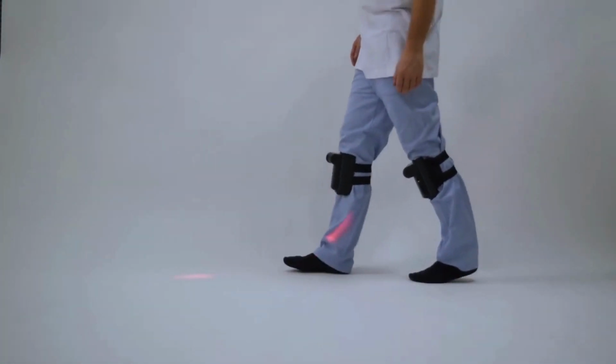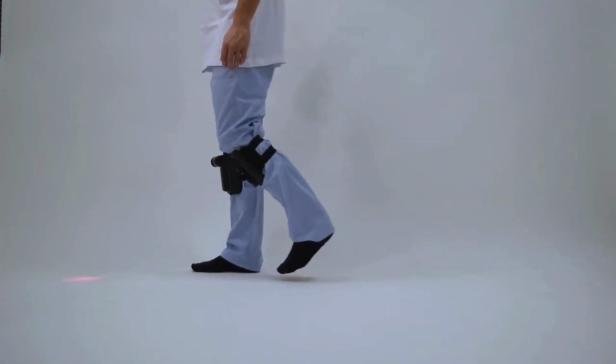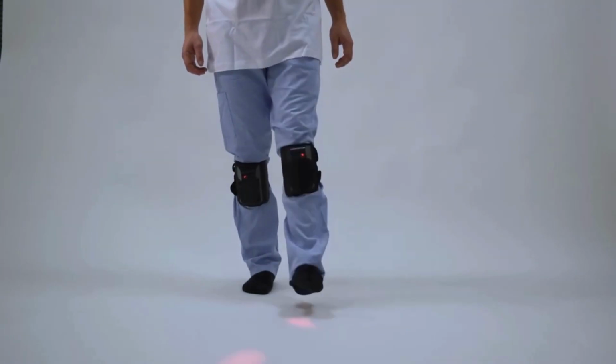Fast walking. In this exercise, the patient is required to walk at a faster pace than his or her standard. Visual feedback helps to maintain the pace and stride length indicated by the physiotherapist.